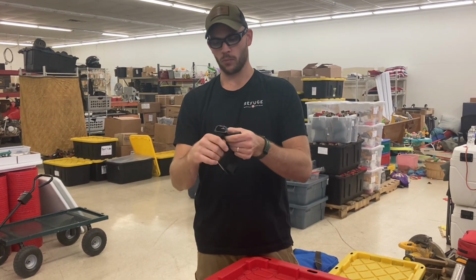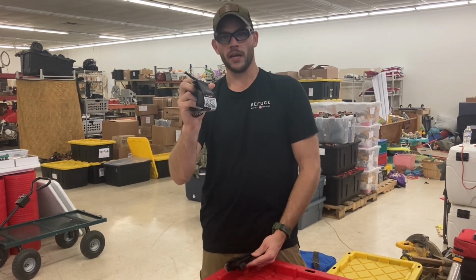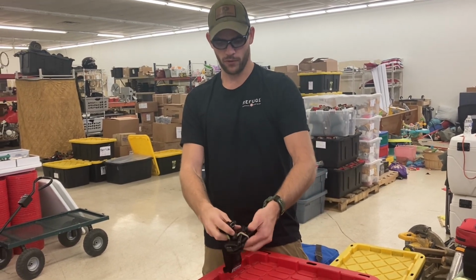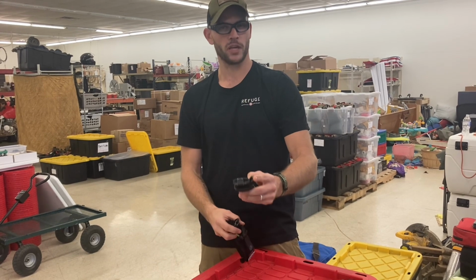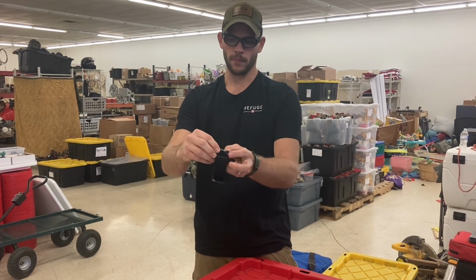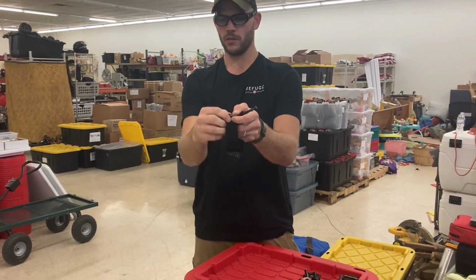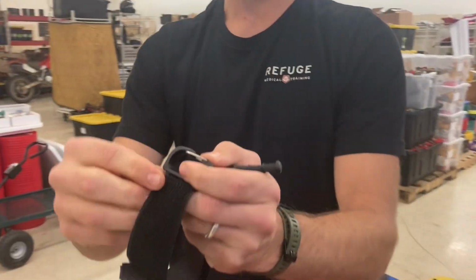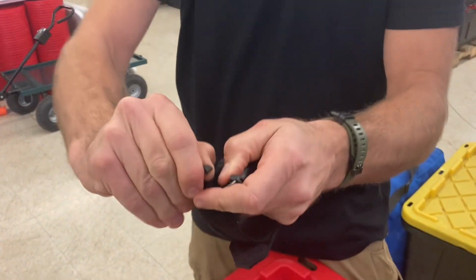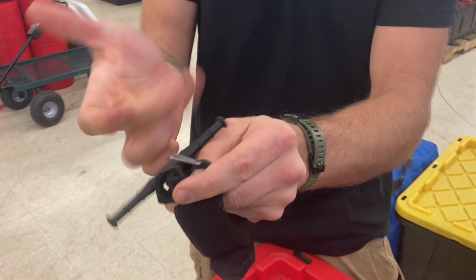So now to break down some of my concerns about it before I even demo. The windlass on this is very short. It is very difficult to keep a hand on. It feels even physically shorter than the SOFTT, and I have some trouble keeping a hand on that under stress. The C-clamp on this section here, I'll just call it a C-clamp, flexes extremely easily. You can see that without much effort, right? It torques because the polymer is really thin. So you can see this move, and if it moves, then part of what you designed this to do comes out of place.